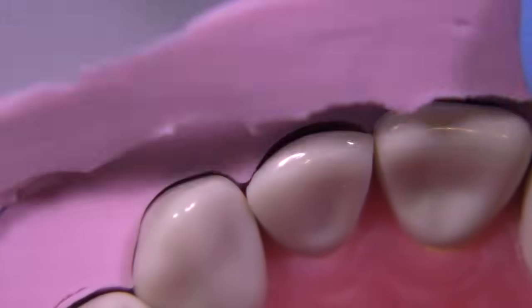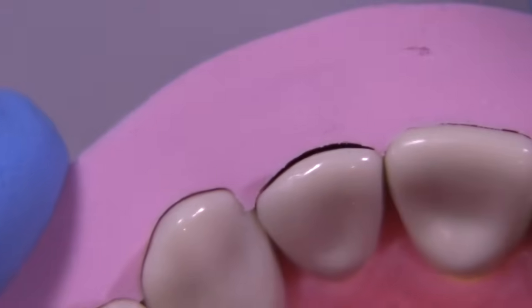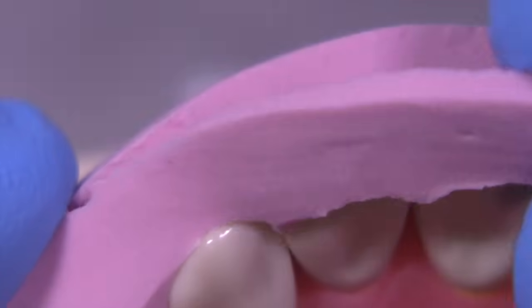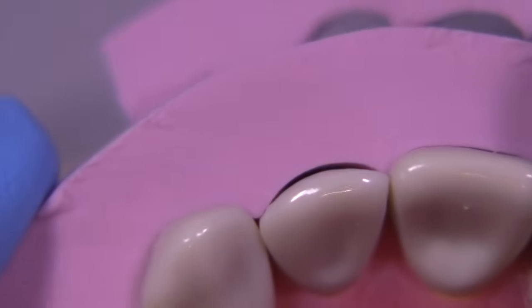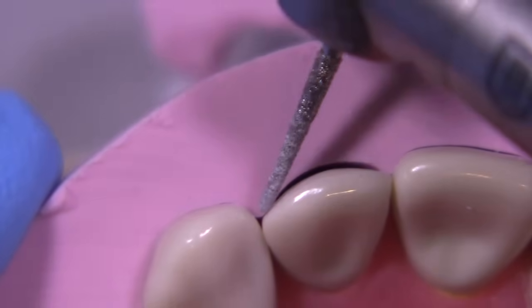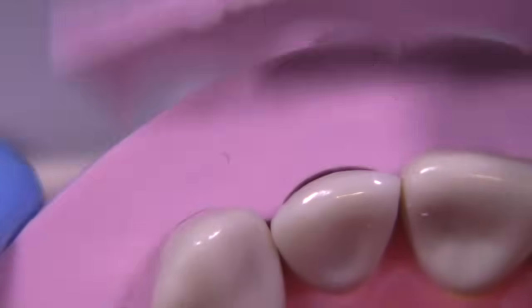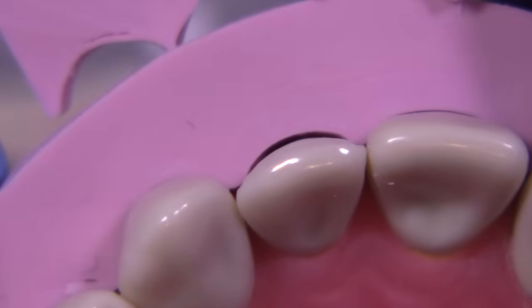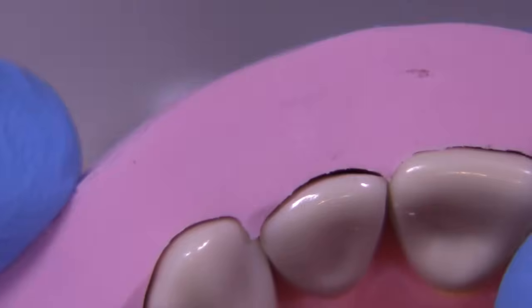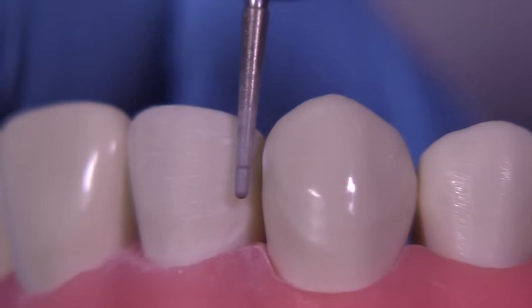But putting this back together again, we can see that that distal portion might need to be reduced a little bit more in the middle third. The incisal third is much closer to what we would want. If we want to reduce a little bit more incisally to give a little bit more characterization of the ceramic, that's not a bad idea, but I'm going to give you the most conservative possible design for a facial prep veneer. Obviously, a no prep veneer is the ultimate conservative preparation, is no preparation at all.